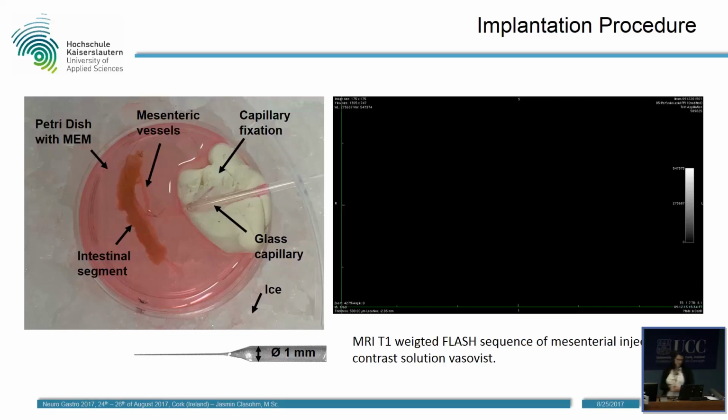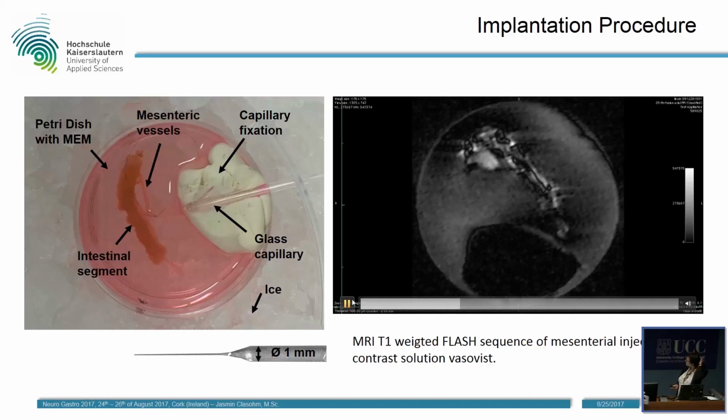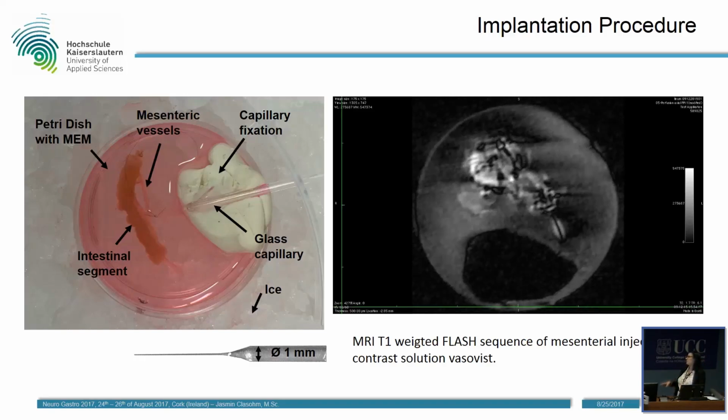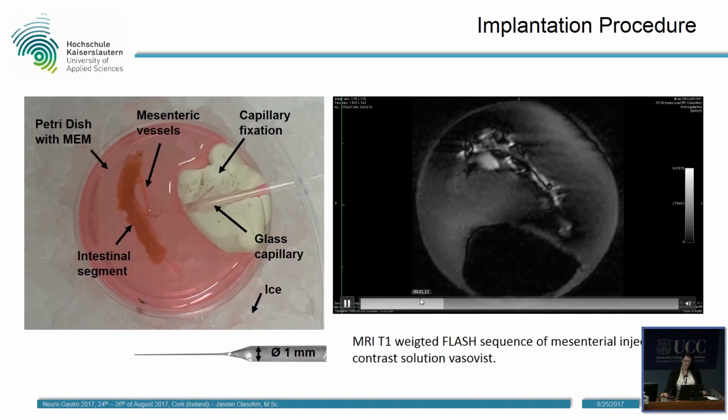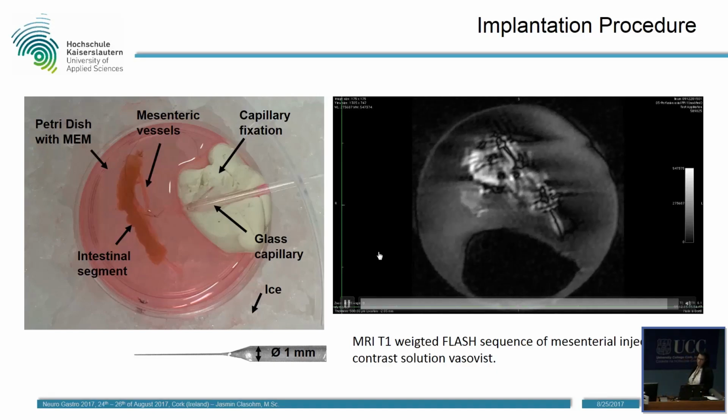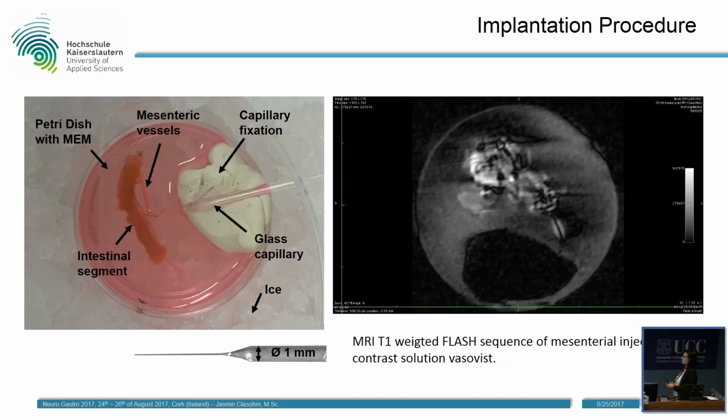And in this image, I hope I can start it by this. You see a time-lapse movie of the injection of contrast medium. I will start it again. In this video, you can clearly see that the contrast solution is distributed over the whole gut segment, and we have no leakage over there.